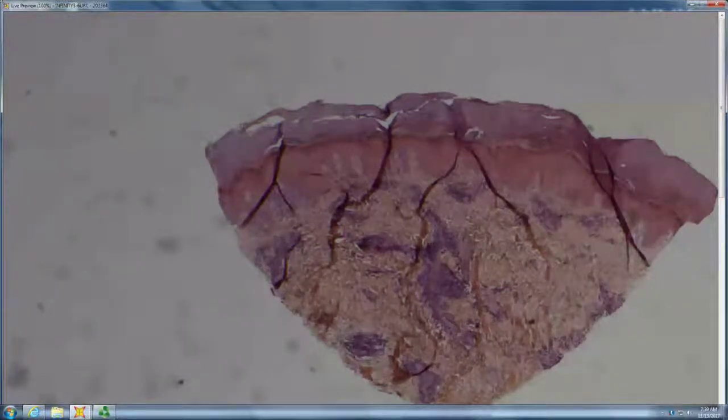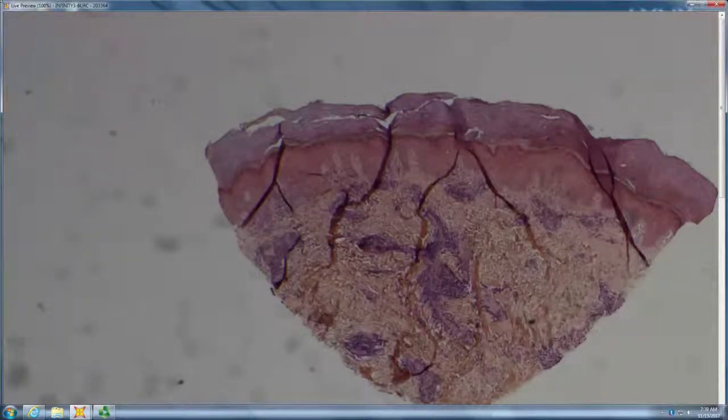Now, are the vessels in this one normal, or is there something in the vessel? Looks like there might be a thrombus in the vessel. It stains really bright. Remember what the center of a rheumatoid nodule stains like? Fibrin, intense red. This is that same red, right? So that's a fibrin thrombus sitting in the vessel.